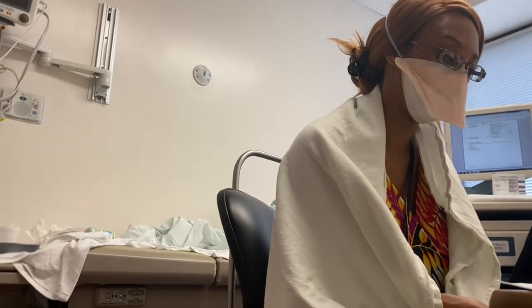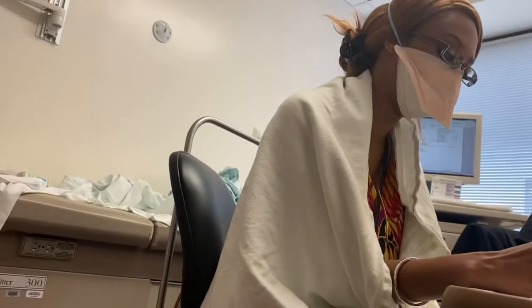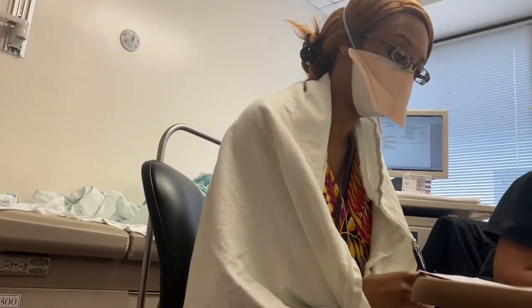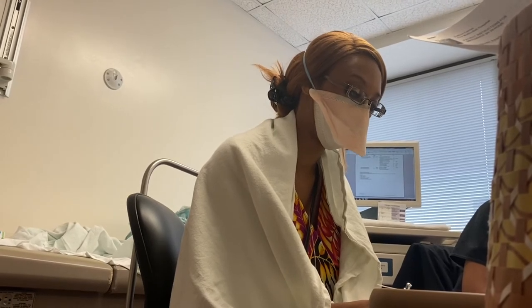So you can have what you want to while you eat, while you have snacks, okay? Number two, no extremely hot or cold foods, lukewarm or room temperature food. The probe doesn't register well if it's steaming hot or ice cold. So let your food get lukewarm, and please nothing frozen, no ice cream or ice things, okay?